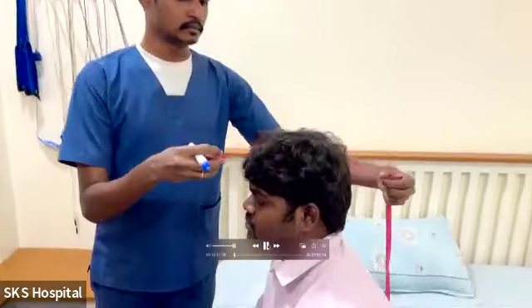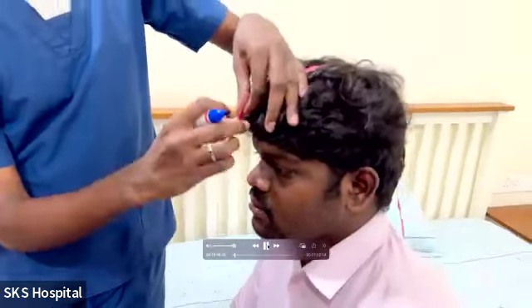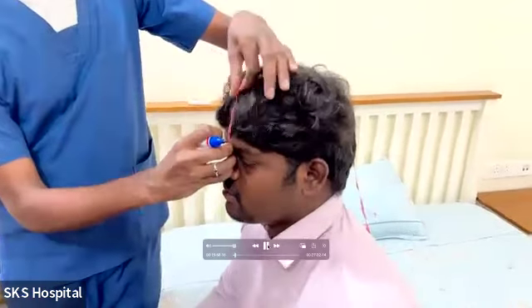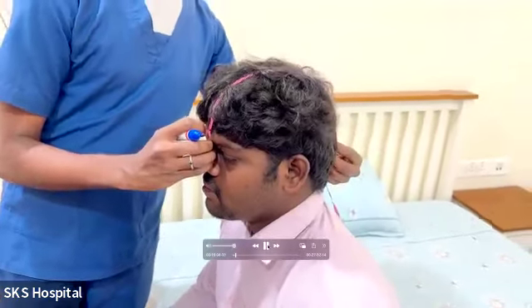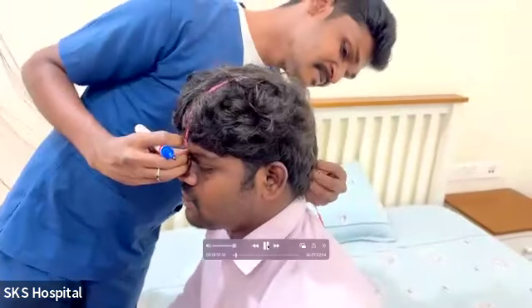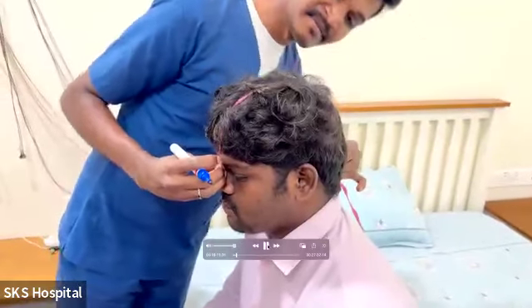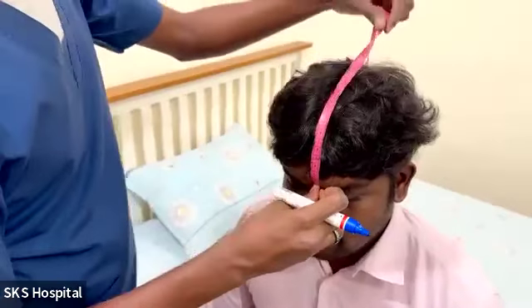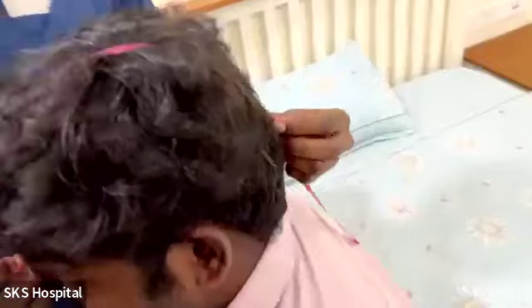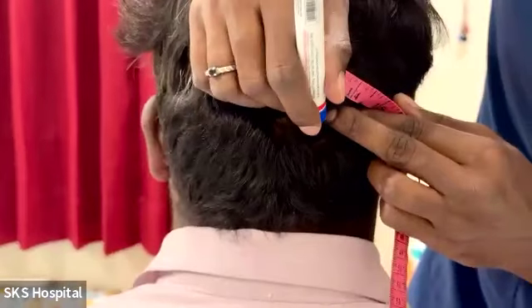First, let us start with the initial finding of the nasion and inion and marking it with a marker, and then measuring the distance from nasion to inion. Note it down so that you can find 10% and 20% as and when required. This is a closer look at the same measurement, where you can see the nasion and inion being measured and marked.